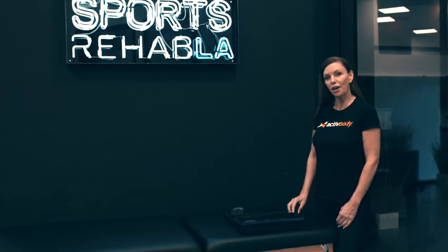We're here at Sports Rehab LA, where Dr. Laura is going to teach us how to use the device and the app together.